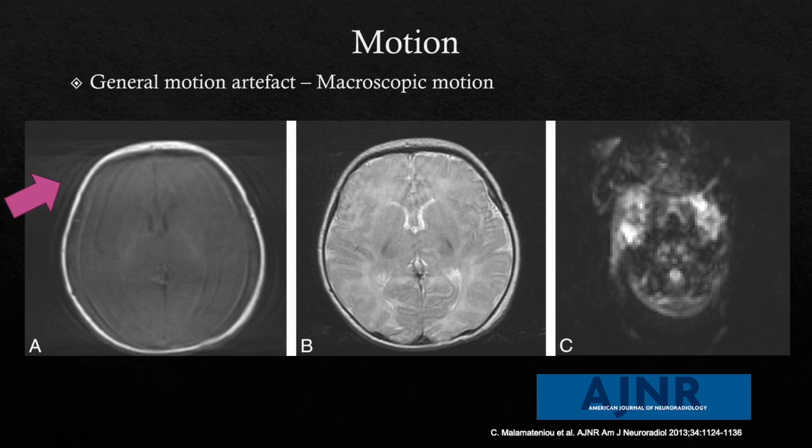There is quite a lot of air-tissue interface artefact, and the motion is included here too, so you have some of that ghosting plus the air-tissue interface artefact. Although that area is quite problematic, further up in the parenchyma you do have a high diagnostic yield because these scans can be quite quick. So they're quite robust to motion when you're looking at parenchymal pathology, and they are usually quite good.